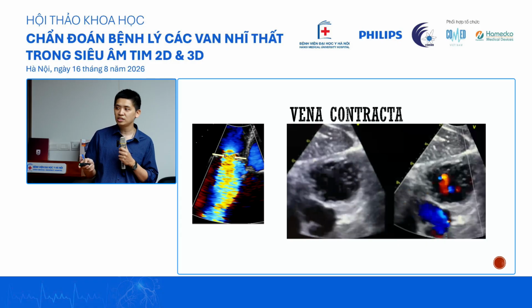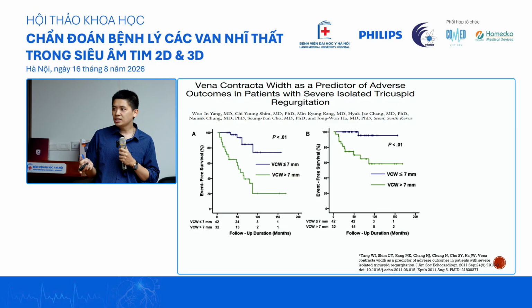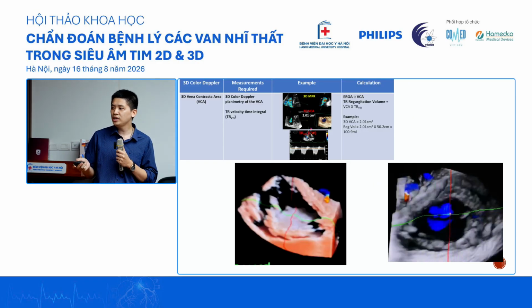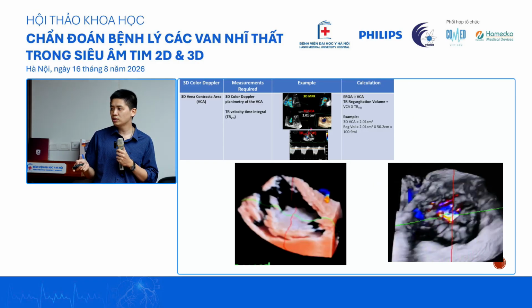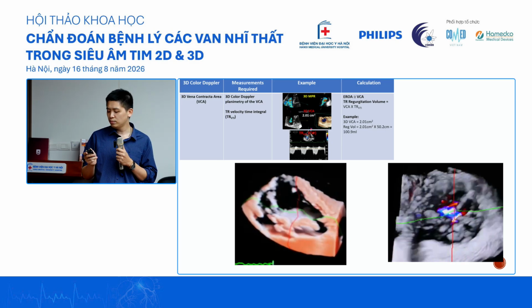The vena contracta assumes a circular shape, but on the en face view you can definitely see this is not a circular structure at all. This is anything but a circular structure, and depending on where you cut the line, it could be very different. But should we trust the VC then? The research has been done. If you take the cut point of 7 millimeters, if it's over 7 millimeters, it usually relates to prognosis, and you probably should do something about the tricuspid regurgitation. This is where 3D could come in. We could determine the 3D area of the VC with the help of 3D imaging.